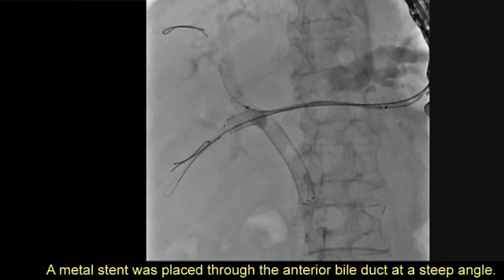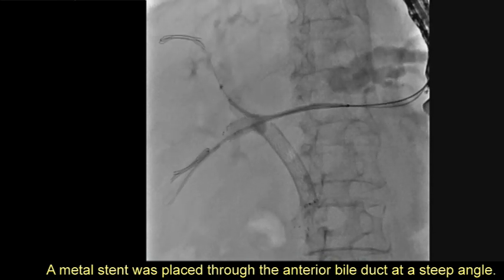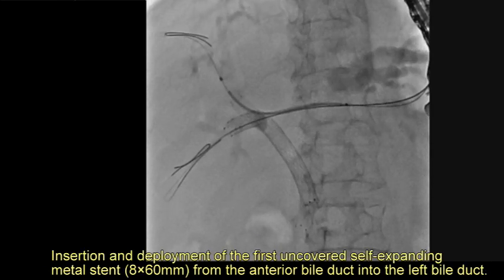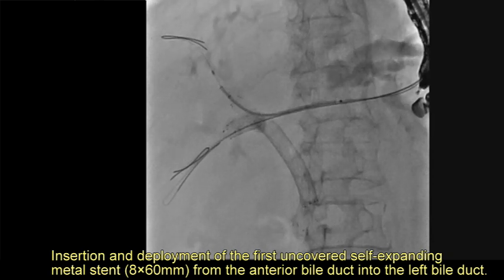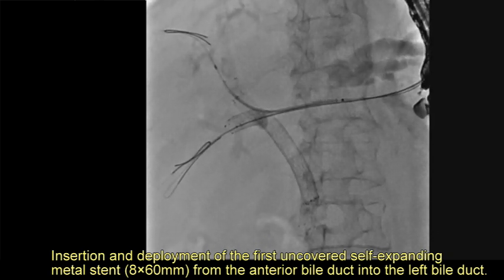A metal stent was placed through the anterior bile duct at a steep angle. The first uncovered self-expanding metal stent, 8 by 60 mm, was inserted and deployed from the anterior bile duct into the left bile duct.